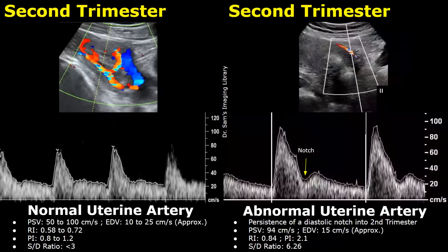This is an abnormal uterine artery spectral Doppler waveform in the second trimester. There is persistence of a diastolic notch into the second trimester — we can see this groove right here. This may indicate an abnormality, but the resistive index, pulsatility index, and SD ratio are more reliable parameters which may indicate an abnormality.